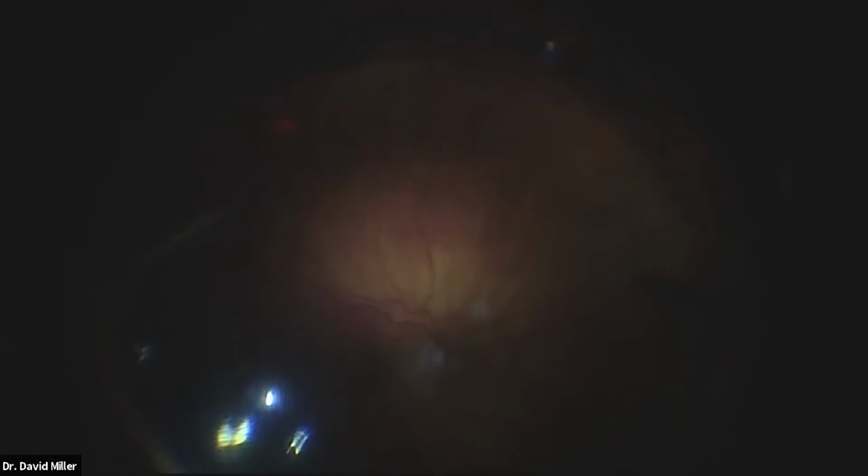Small retinotomy. You can see the areas of pigmented lattice down below, some choroidal scarring near the paving stone. We can go ahead and put a little bit of laser around that. Again, I don't think it's absolutely necessary to even do this because we didn't find any tears down here. We got a nice, good, clear look. We have good visualization in this case, which is a nice help in terms of being confident. But just in case we missed a tiny break around these weak areas or these thin areas, it never hurts to put a little laser near them.